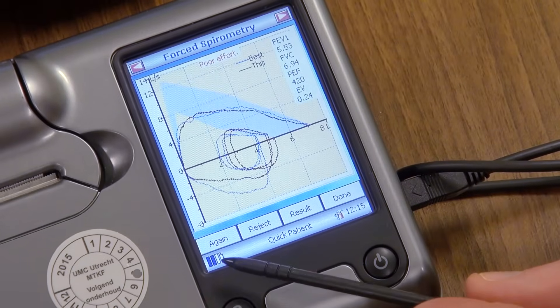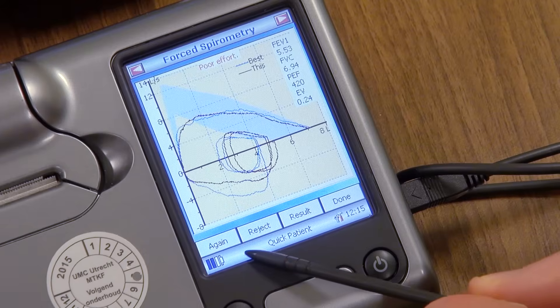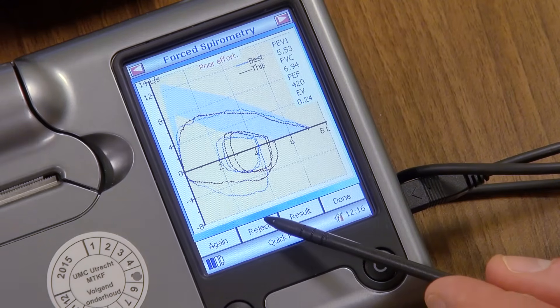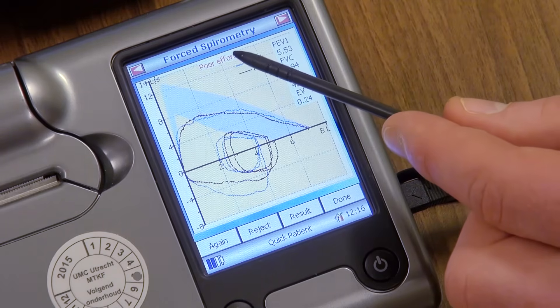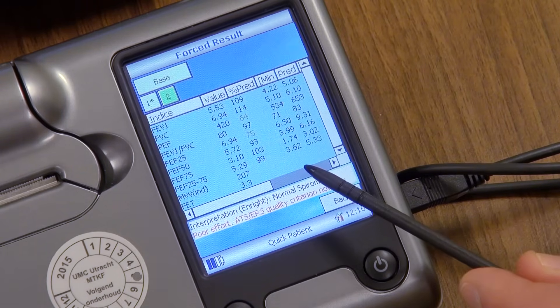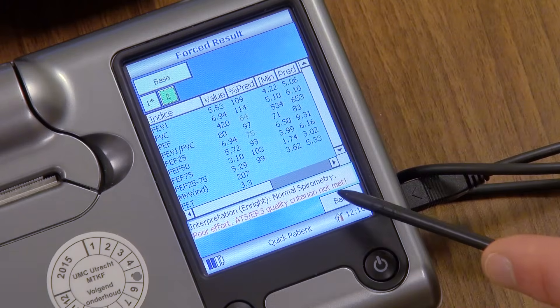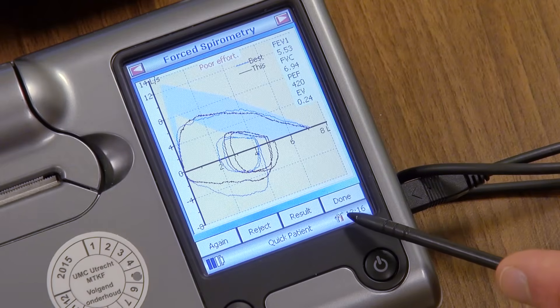Once the testing is complete, you will be able to select different options on the device. You can press again if you wish to perform another test. You can press reject if the device indicates that the blow was insufficient. You can press results to view the results of the test. Here, you will be able to review the results from all the tests you have done. Finally, if the testing is complete, you can press done.